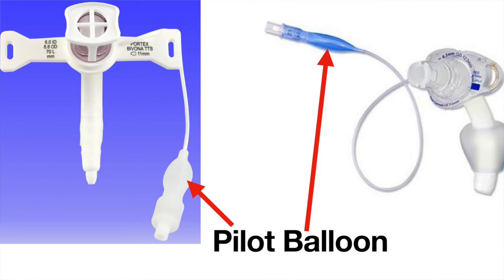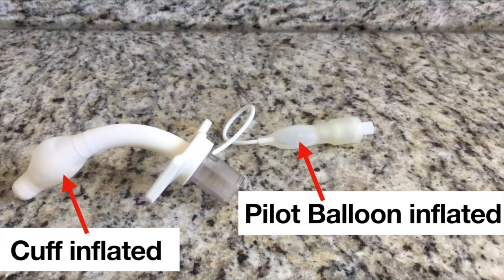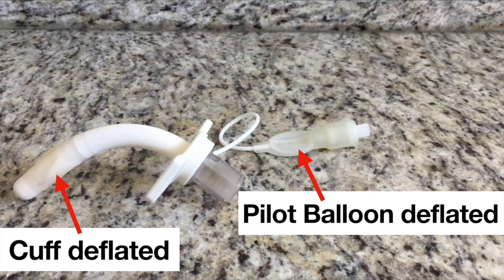At the end of the pilot line or inflation line, there is a small balloon-like structure. This is called the pilot balloon. If the pilot balloon is inflated, this means the cuff on the tracheostomy tube is inflated. If the pilot balloon is deflated, this means the cuff on the tracheostomy tube is deflated.